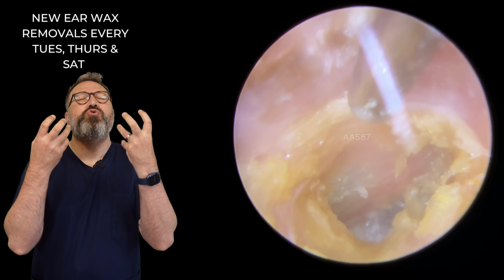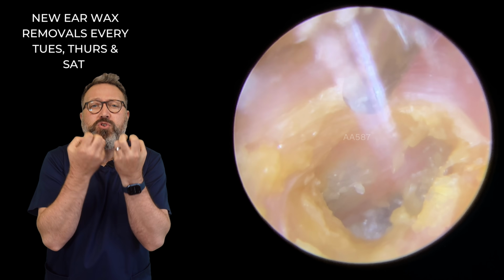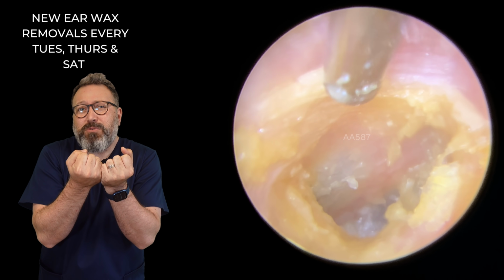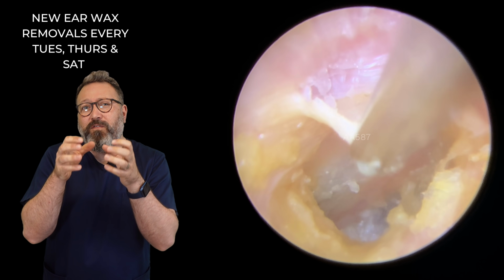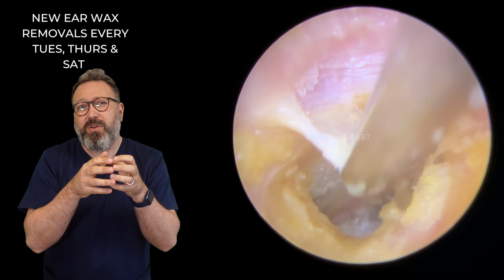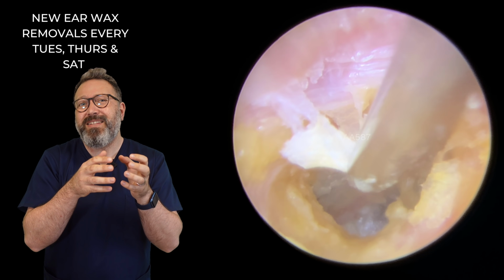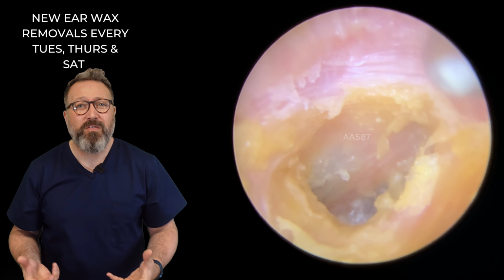Now this skin is dry as a bone. It has gone so dry, so solid in here. You can see as we peel this away just how firmly attached it is to the canal wall. So as I'm trying to pull this down, it's got to come away because it's all dead skin, and this deep in the ear canal it's not going to migrate out very well.